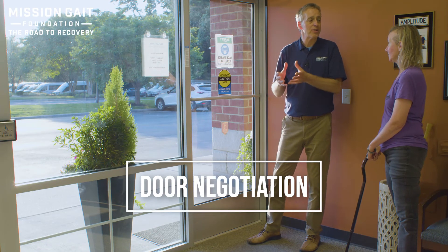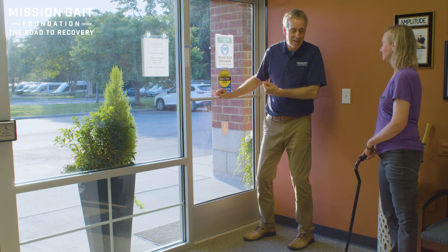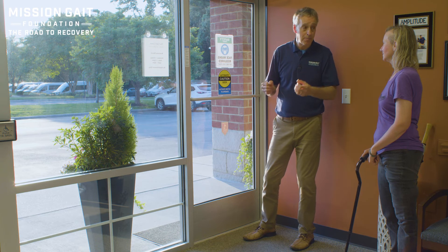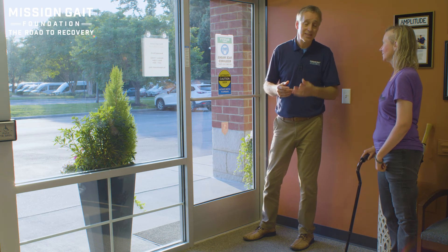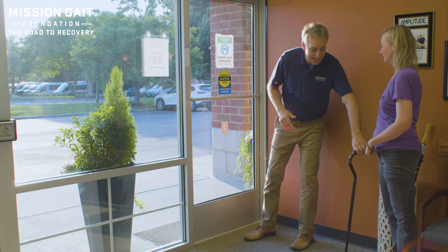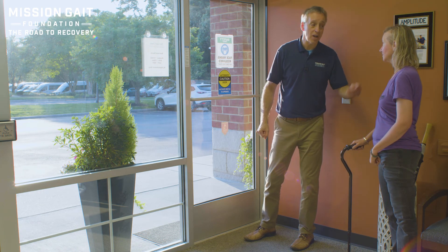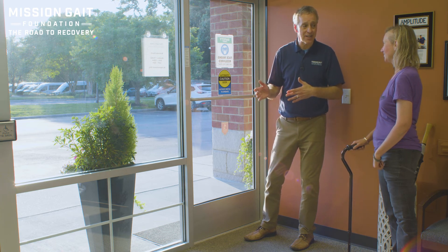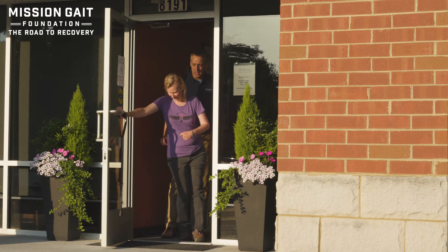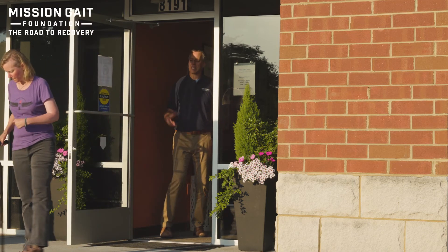Now we're talking about going through a doorway or transitions. Power doors are great but they're also very heavy. As you start going through a doorway, you're going to feel a lot of resistance. But about halfway through that door, when you're pushing as hard as you can, the power is going to pick up and it's going to end up opening on you. You need to be prepared for that so you don't lose your balance. Second of all, if it takes you a second to get through the door, a lot of these power doors are set on a timer and it's going to close. When that closes, use your cane on the side of the door and press it right up to where the door is going to be — so when it comes and closes, it doesn't knock you over. It hits the cane and then it'll reopen itself on that contact. You can use the cane as a stopper to keep that door open.